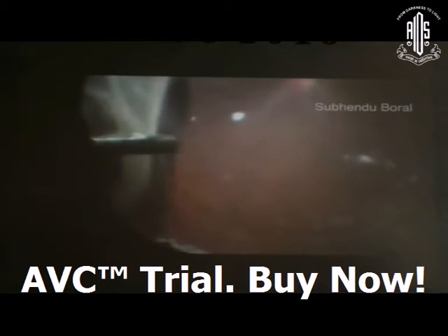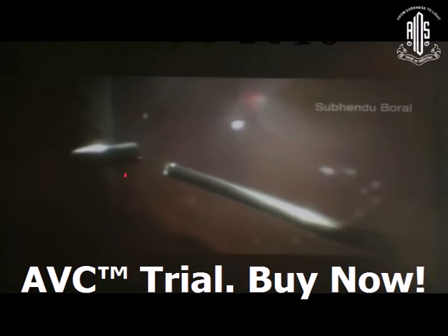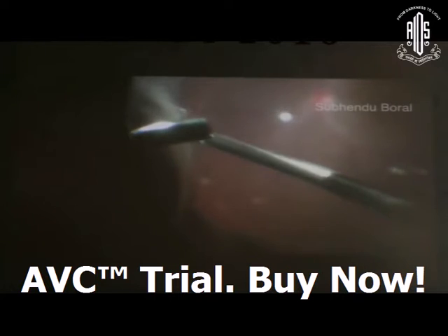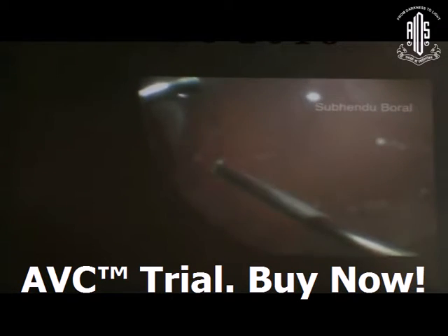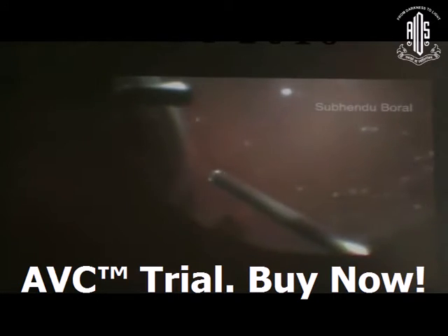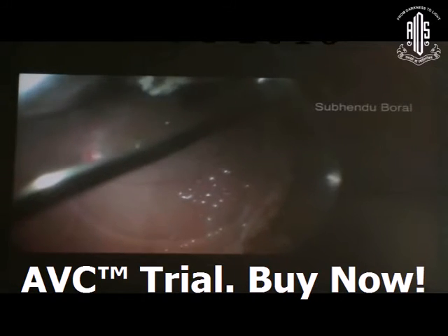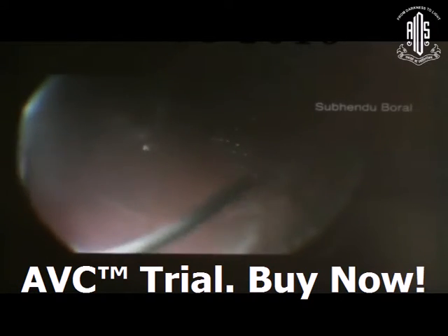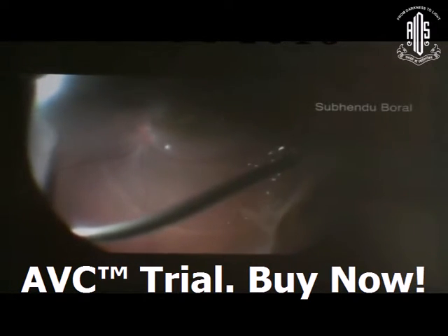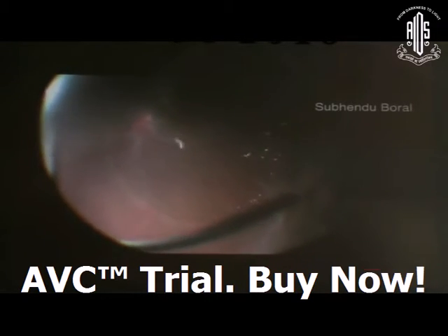See the vitreous adhesions around your left-hand cannula and trim well using suction to remove all vitreous adhesions around the cannula and the peripheral retina. Do not try to separate the PVD at the periphery too aggressively — you should not be desperate to separate the PVD peripherally, to prevent further iatrogenic break formation.